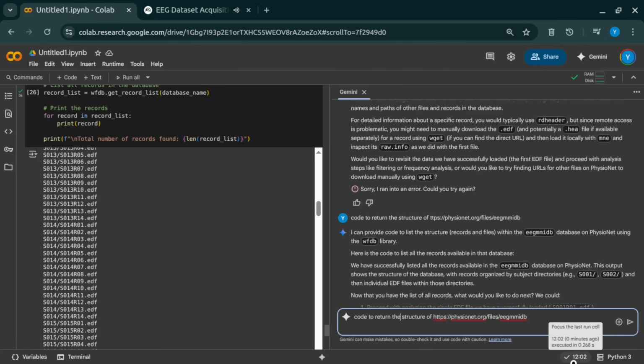to visualize EEG? You mentioned the raw plot. Right, the raw plot is fundamental, but beyond that, you often move to things like spectral plots or spectrograms. Looking at frequencies, like alpha waves, beta waves. Exactly. Those show you the power or intensity of different brain rhythms over time.